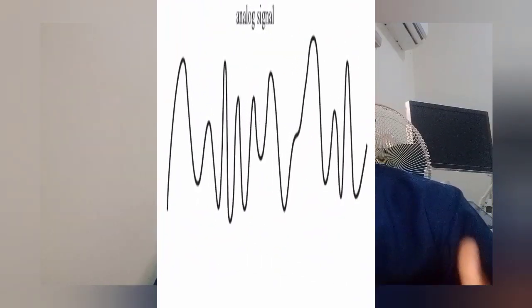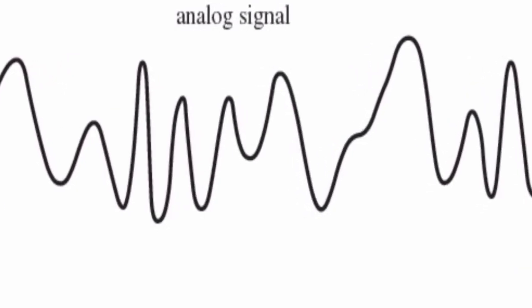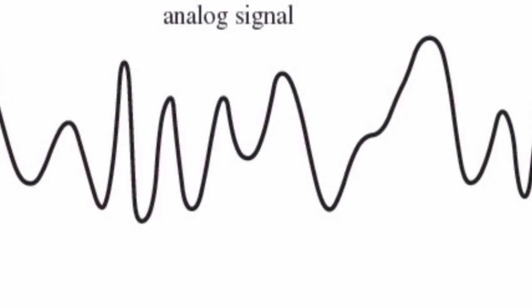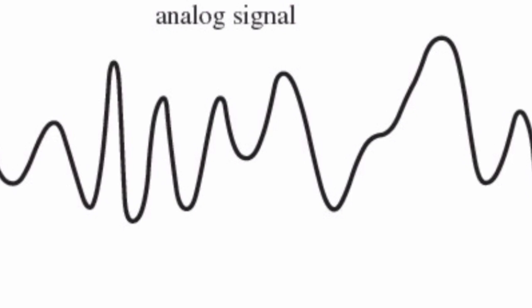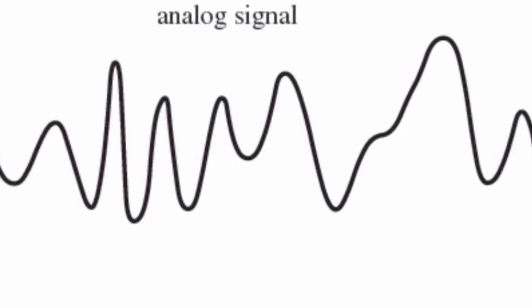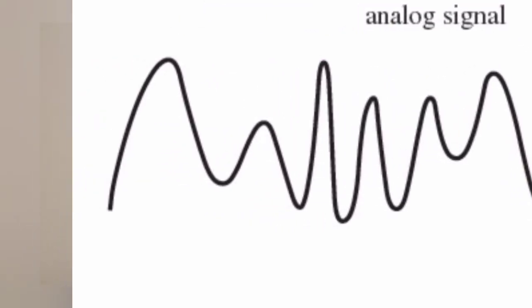You're welcome back. Digital devices is the topic, and we'll do a good job explaining how we got here in ultrasound diagnosis. An analog signal is a signal that has a continuous spectrum of values. The echoes from the tissue interface are analog signals also. So the radio frequency (RF) signal that is produced in the transducer that corresponds to those echoes from the tissue interface are also analog electrical voltage signals.